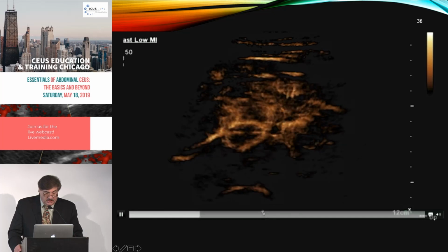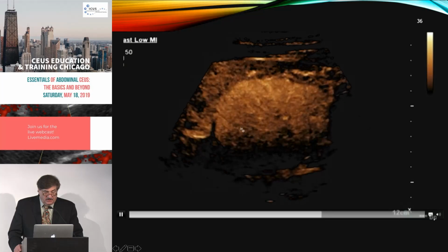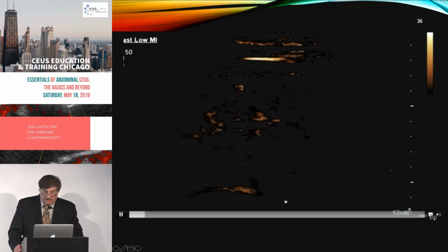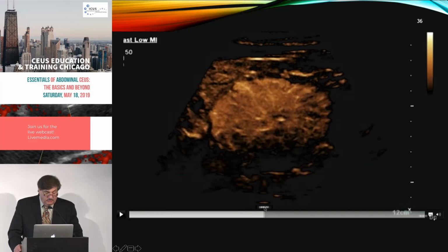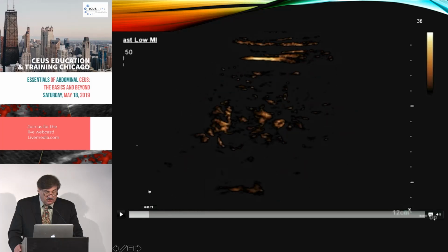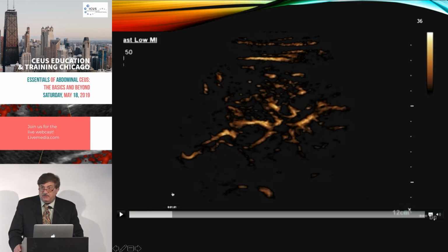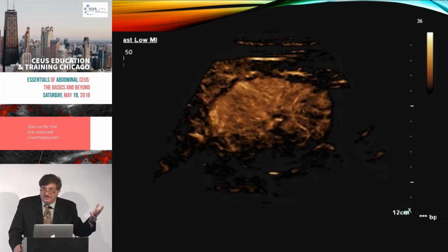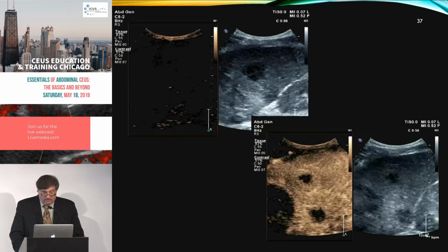Here's an FNH, and again you can see the gorgeous spoke wheel appearance, the marked arterial hyperenhancement. Another thing you should realize is we've got such high temporal resolution that I can stop this clip, pull this back, and go back, and I can now see that the blood flow is really starting in the center and going out, and I can pick some frames that have a nice spoke wheel appearance. Helpful in flash hemangiomas where, poof, it's there. You can go back and see, and you can usually see that they have globular peripheral enhancement.